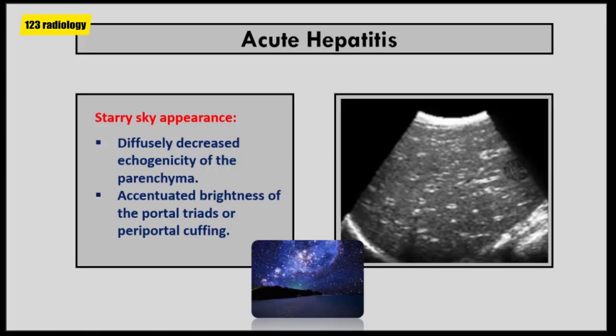This appearance is called starry sky appearance. Starry sky appearance is nonspecific, but most commonly associated with hepatitis. It has poor sensitivity and specificity.